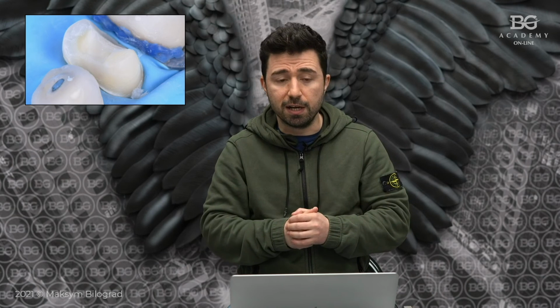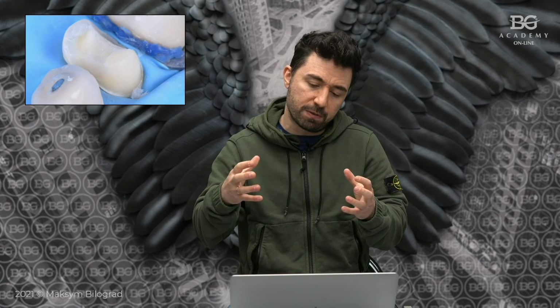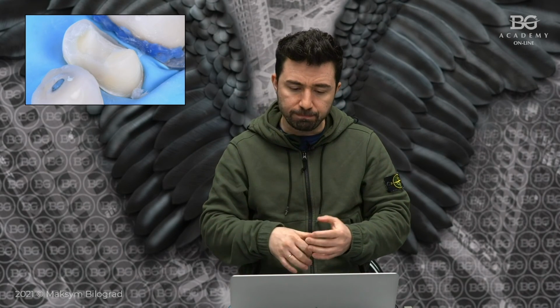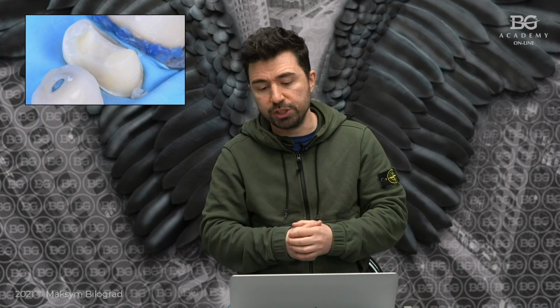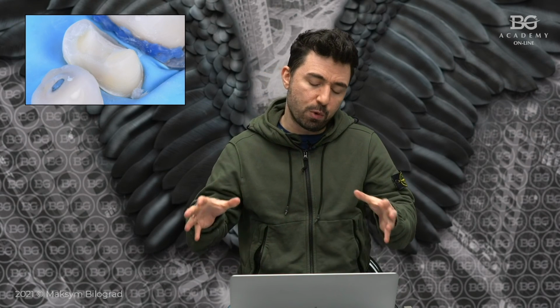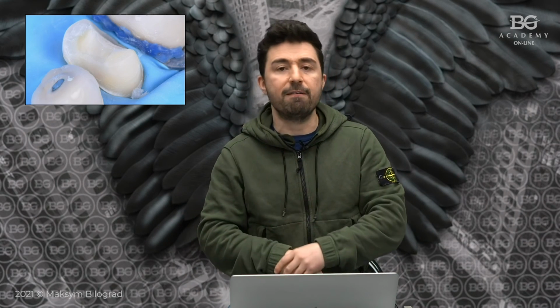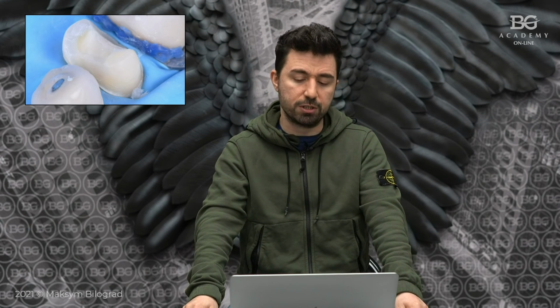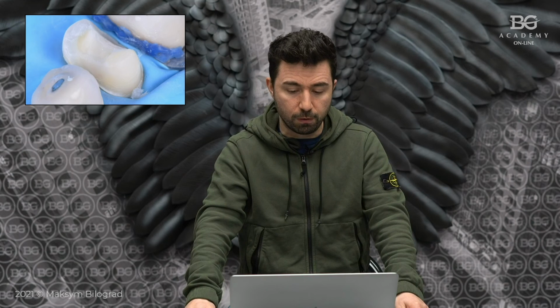By the way, this is also very useful because your endodontic treatment will be easier, because the working length will actually be shorter. Then we did endodontic treatment. During the final irrigation procedures, we were also doing some preparations. Then we finished, we made the build-up, and afterwards we went to the final steps of preparation, impression, and then provisional restoration.